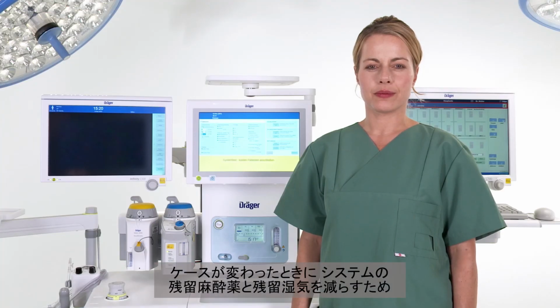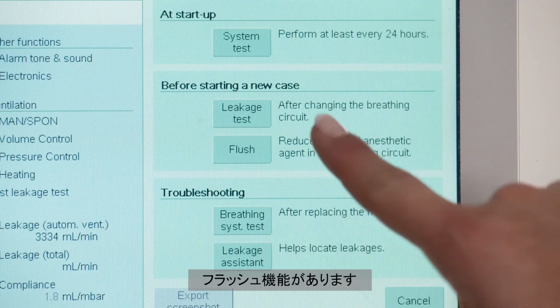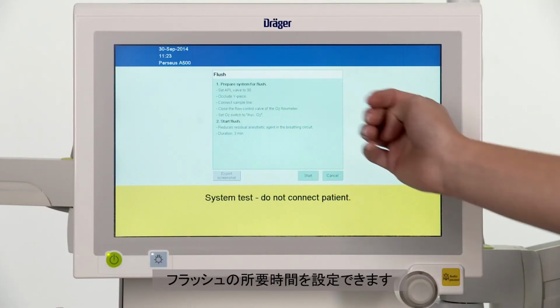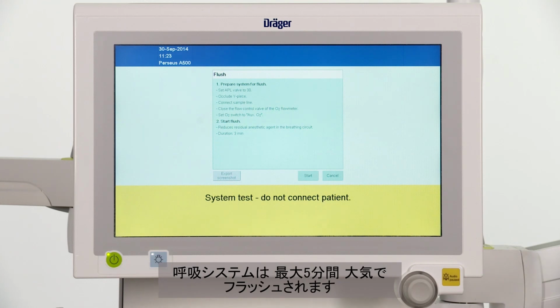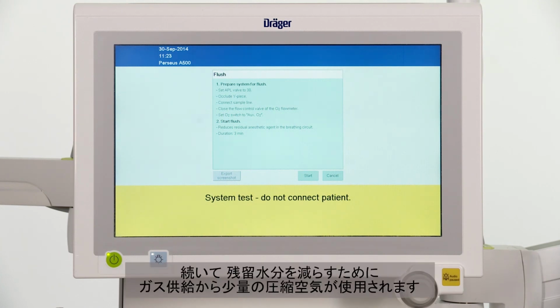In order to reduce residual anesthetic agent and moisture in the system between cases, activate the automatic flushing process. You can configure the duration of the flushing process. The breathing system is flushed for up to 5 minutes with the ambient air. This does not dry out the CO2 absorbent. Subsequently, a small amount of compressed air is used from the gas supply in order to reduce residual moisture.